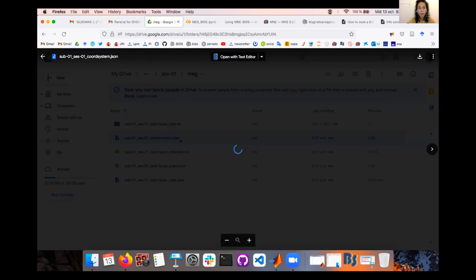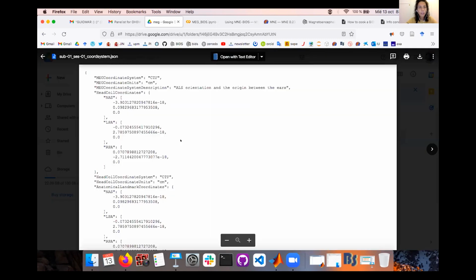So you have a look at what's inside. You will have your MEG coordinate system, the units, centimeters, head coil coordinates, nasion, LPA, RPA. All this is contained in the data, and MNE-BIDS just extracted it and organized it according to BIDS.